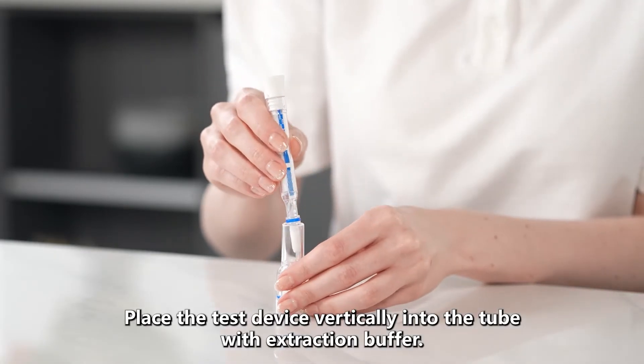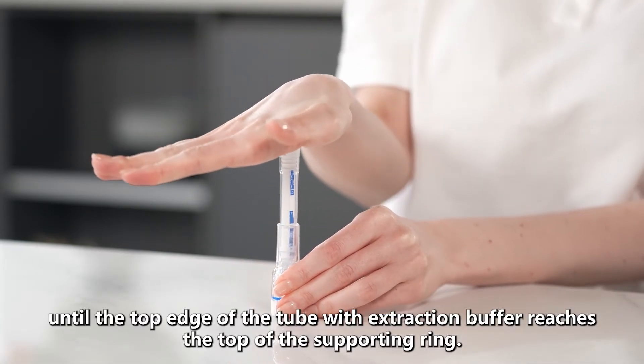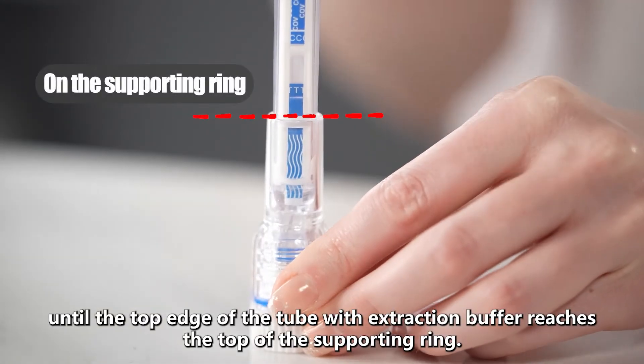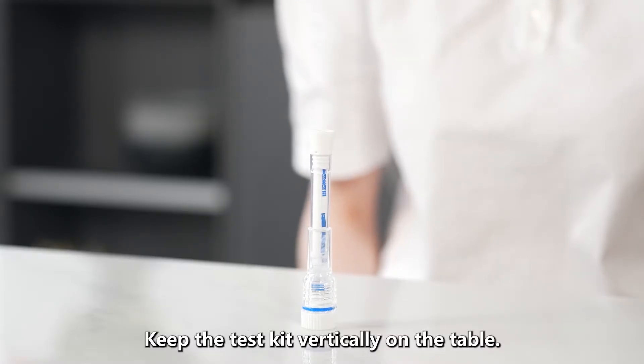Place the test device vertically into the tube with extraction buffer until the top edge of the tube with extraction buffer reaches the top of the supporting ring. Keep the test kit vertically on the table.